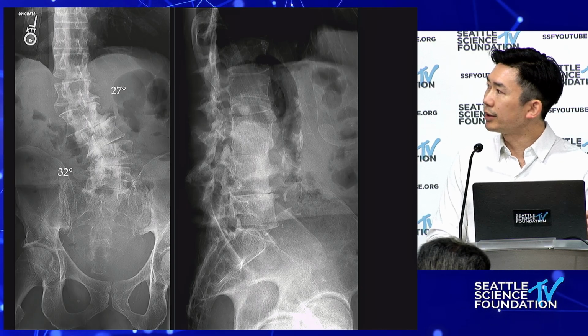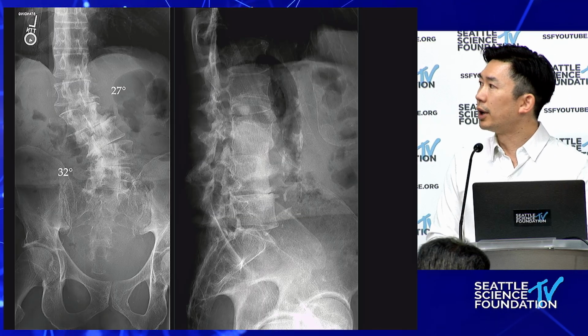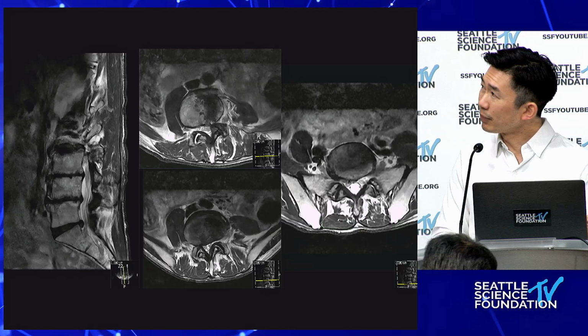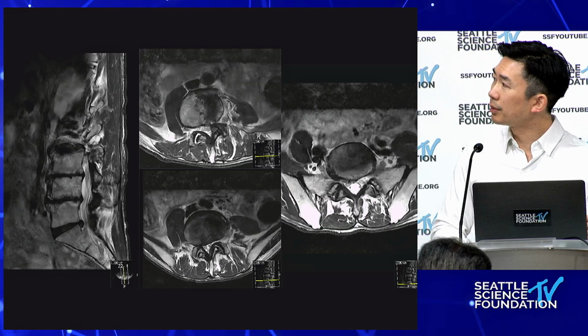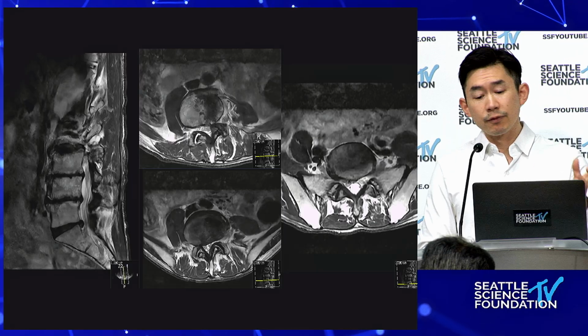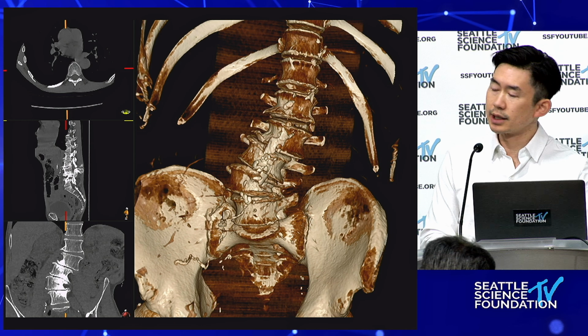And a closer look, he has a more major fractional curve. You can call it primary lumbar curve. But whichever it is, he's certainly off. And then his MRI, top center is L3-4, bottom center is L4-5, and then the far right is L5-S1. So vascular anatomy is favorable on whatever you want to do. And of course, his CT scan here.